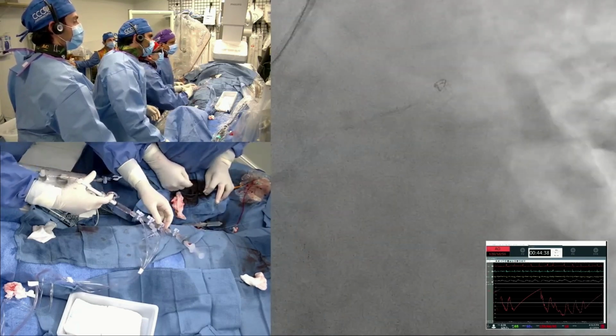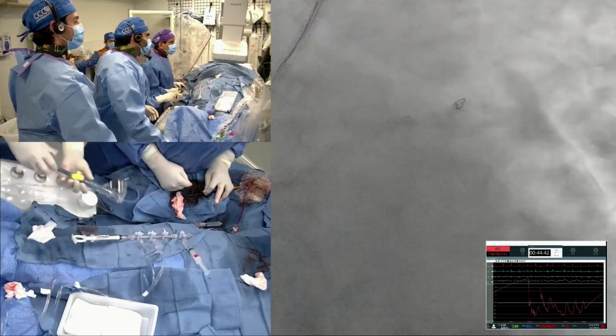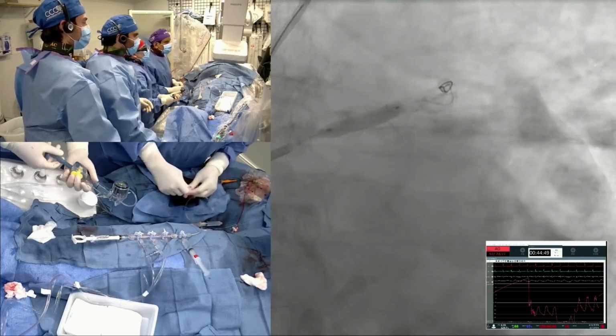So I would probably spend a little money to make it good. No, but for years, cases like this were done without IVL, and they did very well. Absolutely. You'd use a 2.0 burr and then a 3.5 cutting balloon.